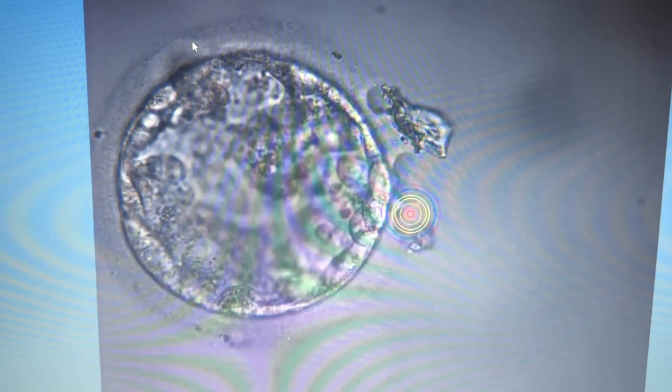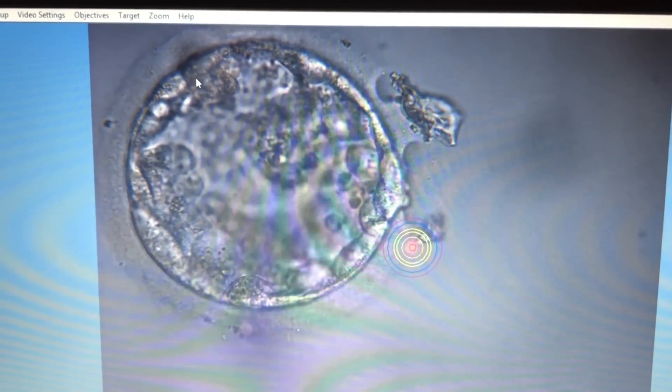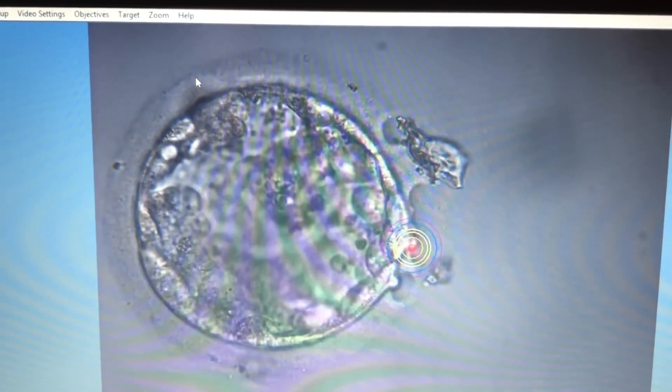You can see here that the laser pulses are being fired at the zona and the embryo begins to hatch out. It is extremely important during this procedure to be very careful as to where the pulses are being fired for the laser.